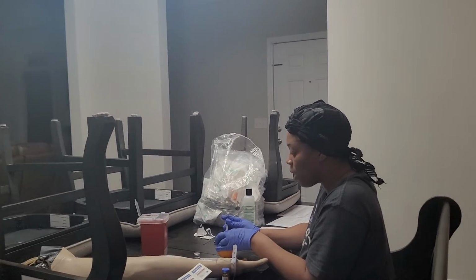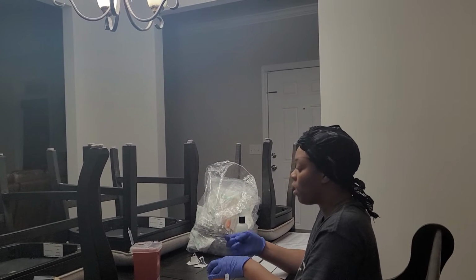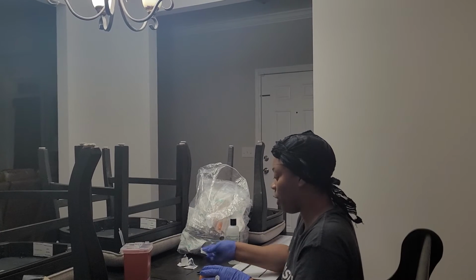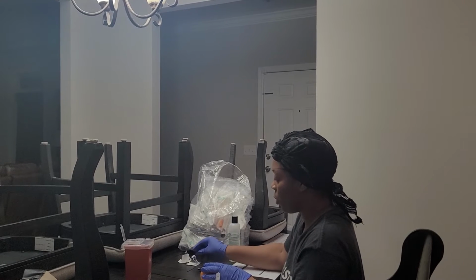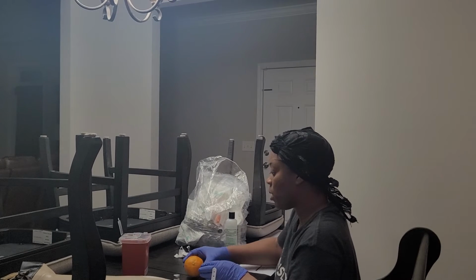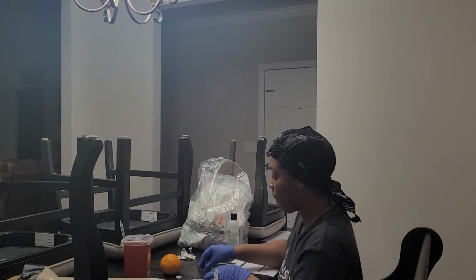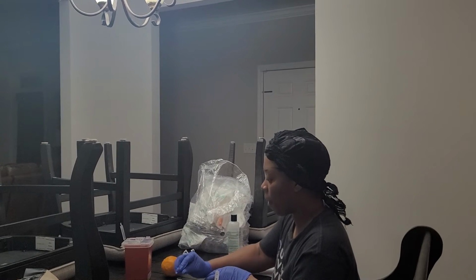for sub-Q injections, and I'm going to insert. I'm going to pop it out, put my safety, discard. And shouldn't be any blood, but just in case, I'll dab the blood. Make sure that there's no blood there. I'm going to ask Miss Larson, how is she doing? Okay? She tells me she's doing just fine. Our trash over here.